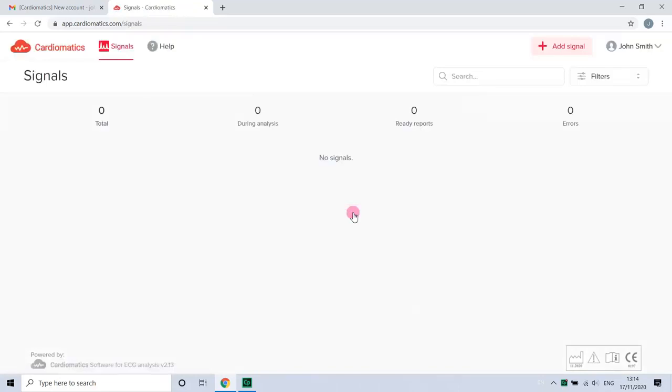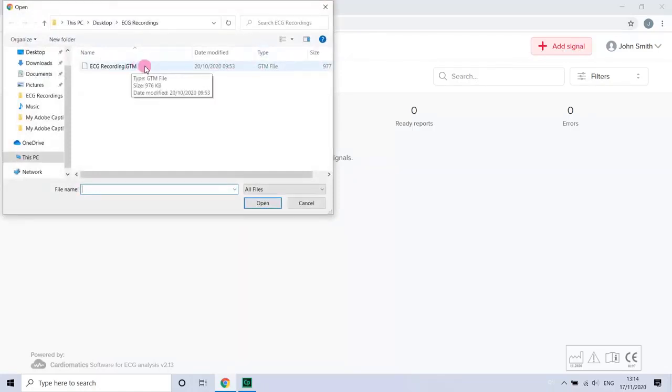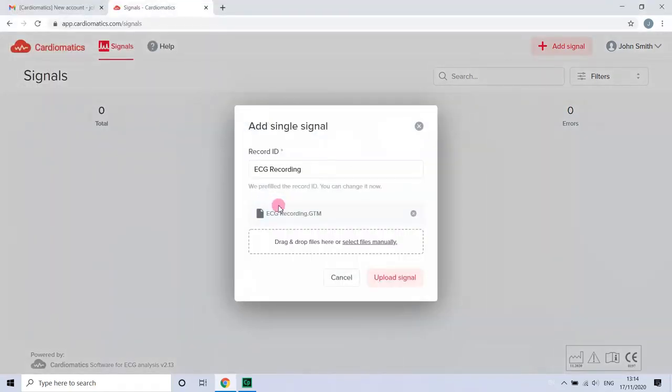After logging into your account, you will see the signals page where you can upload your recordings. To do that, click on the plus add signal or drag and drop a recording from your PC. Select the recording and click upload signal.